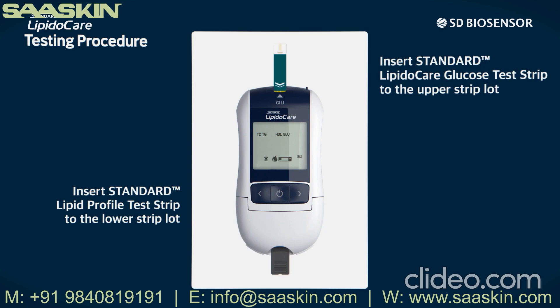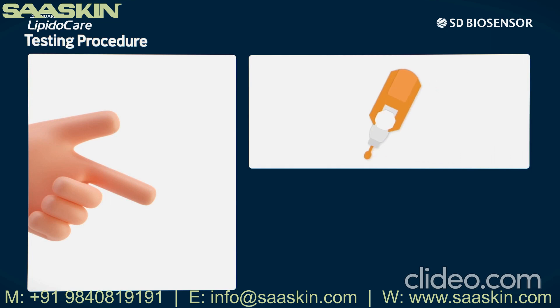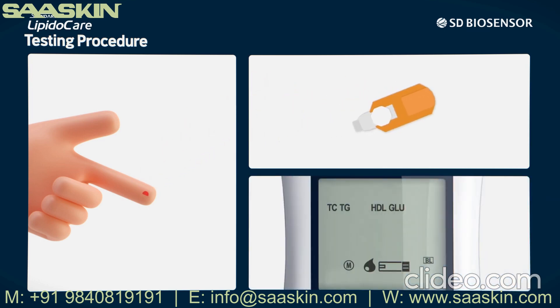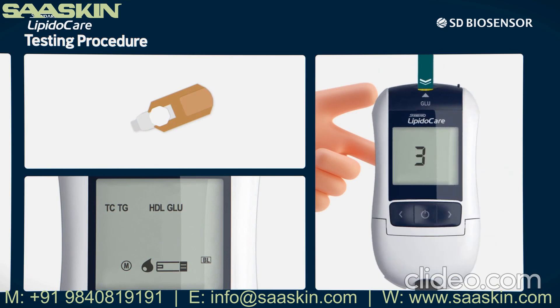Glucose and lipid tests can also be carried out separately. Sanitize the puncture site with a Standard Alcohol Swab and dry it completely. Use the Standard Safety Lancet to obtain a blood sample — twist off the protective cap and pull it out, then place the lancet against the puncture site and gently push it down. When the GLU and blood drop icons flash together, gently apply the blood sample at the tip of the test strip. The test result will be available in 5 seconds.